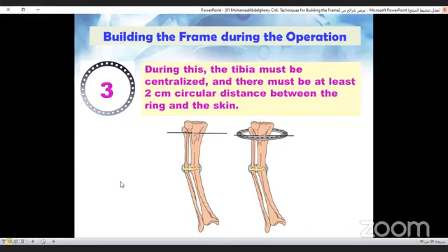Step three, you must centralize the tibia during this and leave at least two centimeters central circular distance between the ring and the skin.